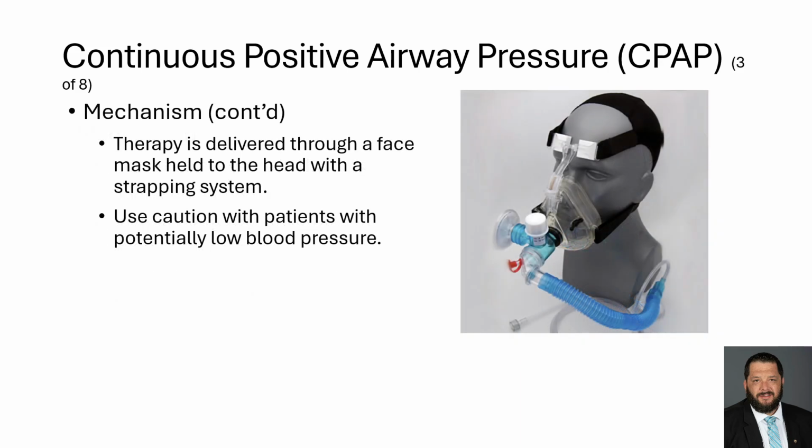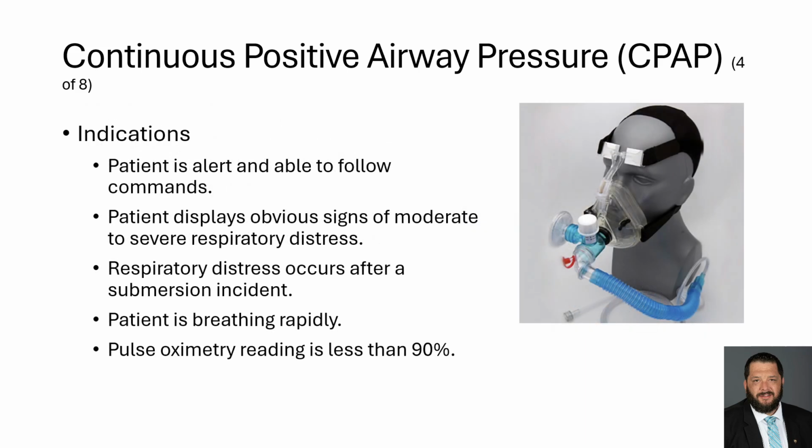Therapy is delivered through a face mask, as you can see here on the screen, with the face mask held in place by a strapping system that's attached to the patient's head. There are several indications and many more contraindications that we'll discuss, but it's important to note the importance of not using CPAP in patients with low blood pressure. Using it in a patient with low blood pressure can result in significant cardiac compromise, as this increase in pressure in the thoracic cavity caused by the use of CPAP can further reduce cardiac output and have significant impacts on the patient's blood pressure.